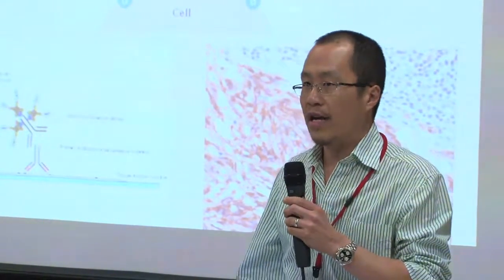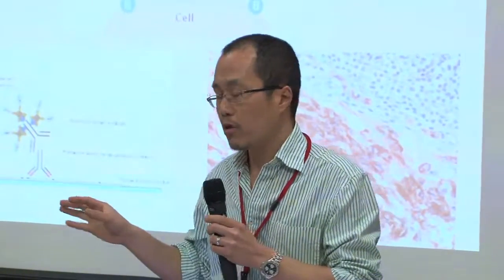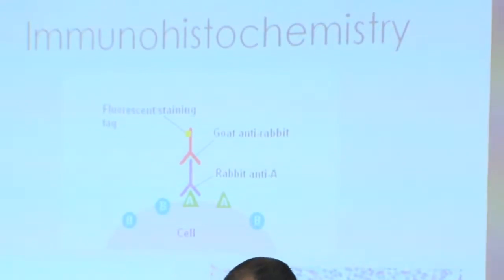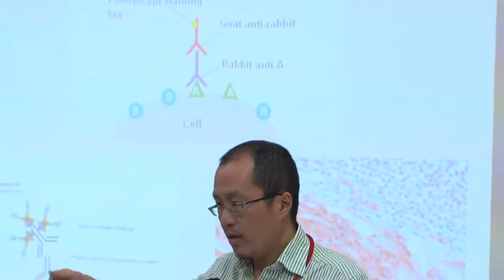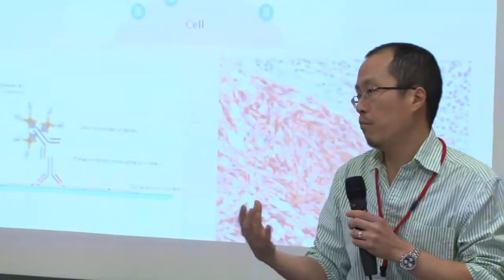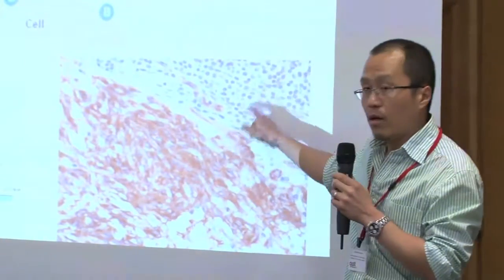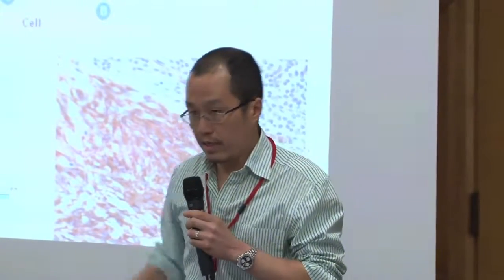Immunohistochemistry, or ICC, or IHC. Immunohistochemistry is based on antibodies, which are proteins which specifically target molecules. So if we were to choose, for example, CD117 or c-kit that a lot of you are aware of, let's pretend that was A, you would raise a specific antibody which only binds to that protein, and then you tag something onto the back of that antibody which allows you to visualize where that specific antibody has bound. Usually we go for a color brown, as shown here. In fact, this is a CD117 antibody which is staining up the GIST. And these negative blue cells are lymphocytes which shouldn't be staining up with CD117. Very important technique, as you'll see.